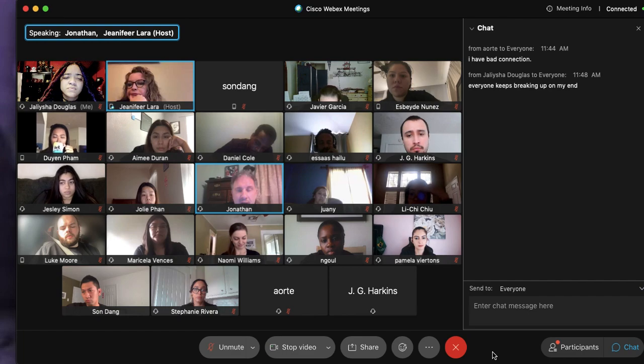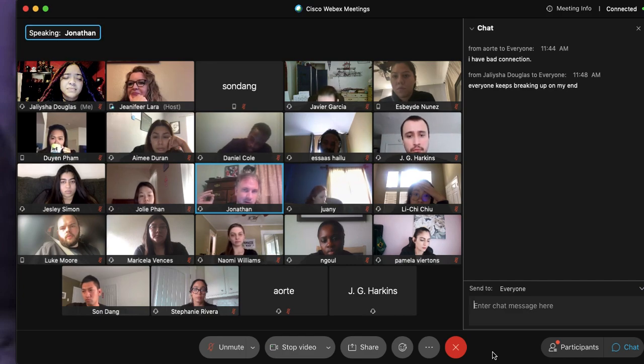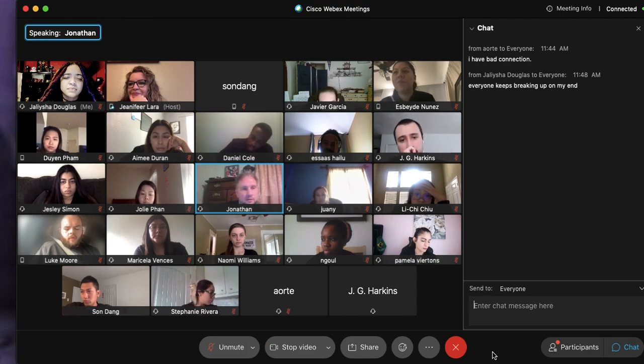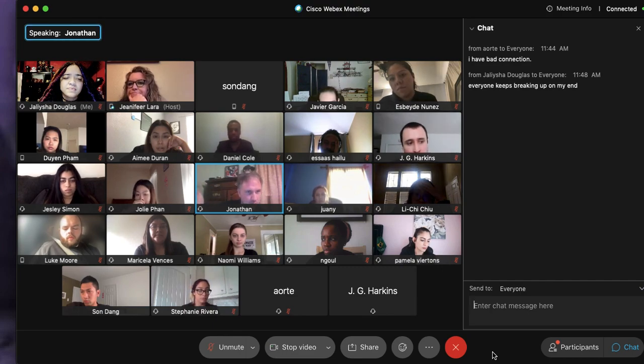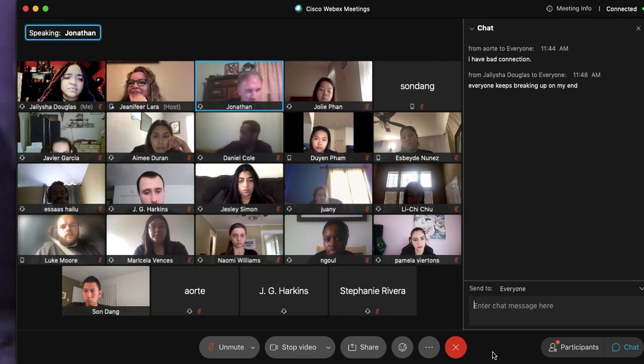Well, based on whatever IR you have, it's going to have a matrix which has individual pixels, and each individual pixel has sensors that are given a different numeric value, and each numeric value is based on the brightness. Brightness level is associated with those numeric values, and so it goes to each area of the tissue or each part of the body, and it reads how much is transmitted or what's not transmitted, and it assigns that numeric value. And that's how it bases the brightness on it, and each one has its own bit depth, so it goes a little bit.